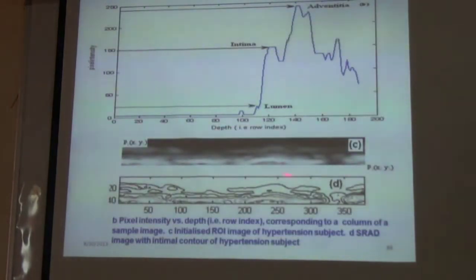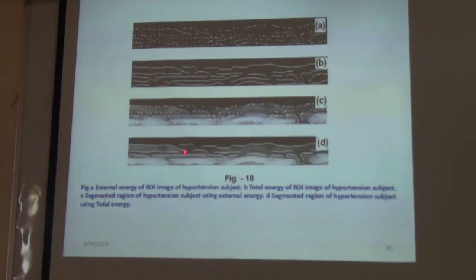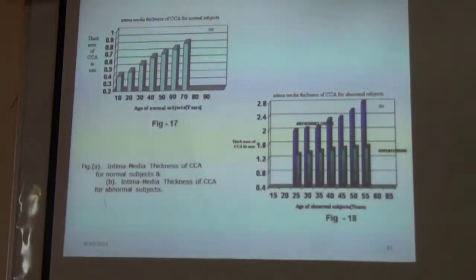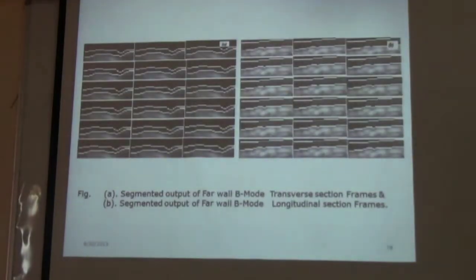So this is a portion which you have taken for active contour segmentation, while keeping this ROI the same. Following the same procedure, keeping that vertex, you are performing intimal layer contour extraction and medial layer contour extraction. After this SRAD reduction, perfect segmentation has been done by this active contour or snake as compared with this segmented value. Could you be able to understand?